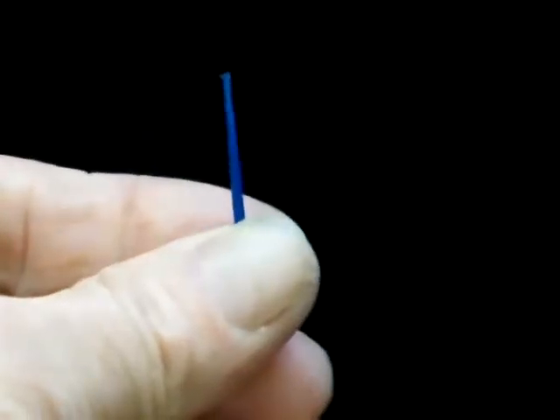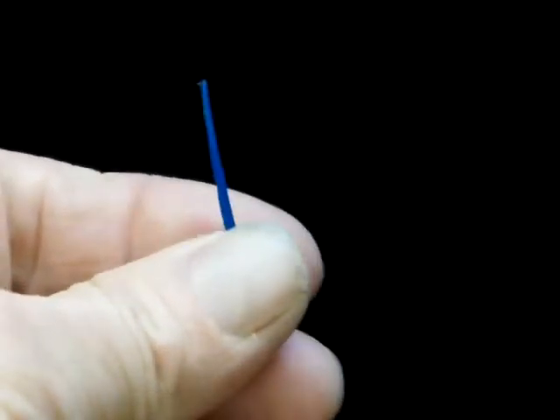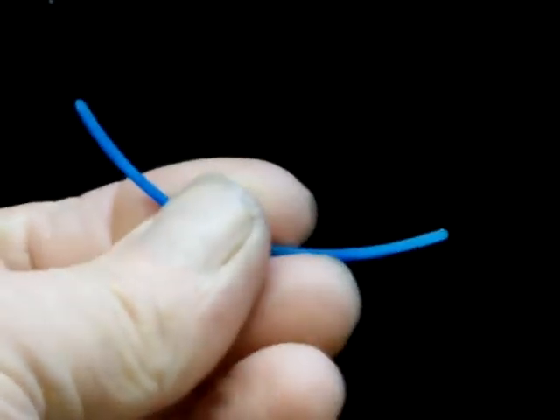I made one end relatively thick for most of my teeth, and the other very thin for my tightest teeth. This easily penetrates between teeth that break any floss.